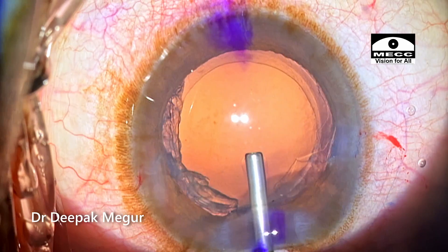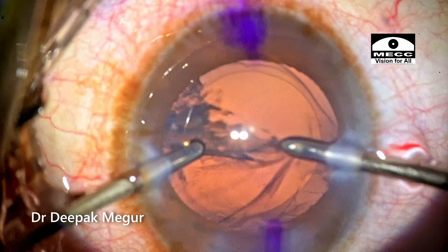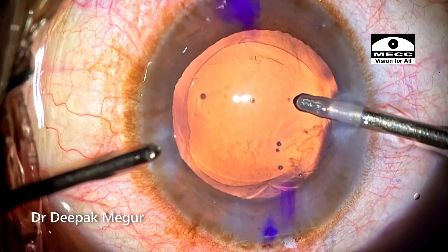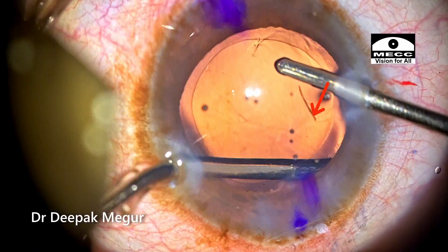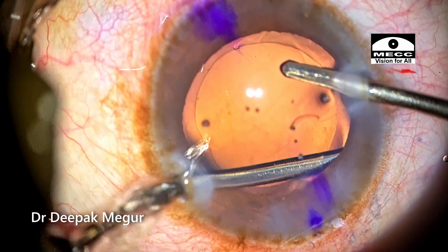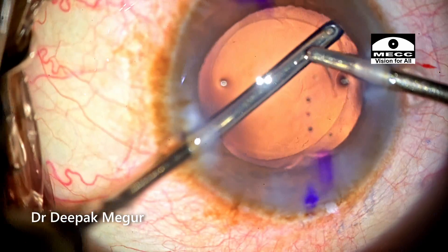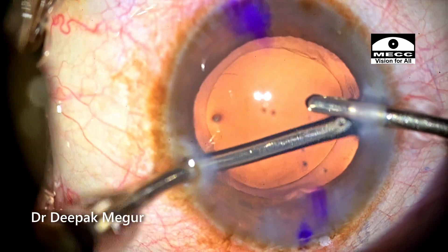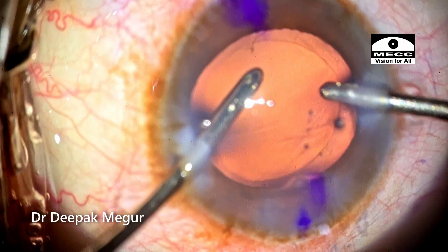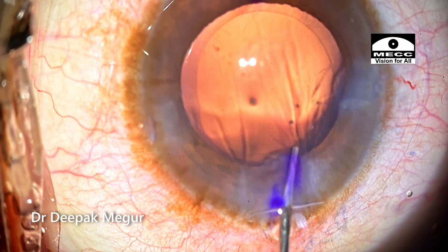I put in OVD now just to provide some tamponade on it as the bimanual irrigation and aspiration cannulas are being introduced into the eye. The I&A cannula switches to remove the cortex from the opposite end. Now as soon as the irrigation cannula enters this side port, we can see that the torn Descemet's membrane is fluttering in full glory. As I'm aspirating the cortex under this fluttering Descemet's membrane flap, I'm conscious that I don't want to engage this flap into the aspiration port. Even if you remove this small part of the Descemet's membrane, I don't think we're going to get into any serious problem, but I'm sure this could be reattached using an air bubble, so I'm just trying to avoid this area.